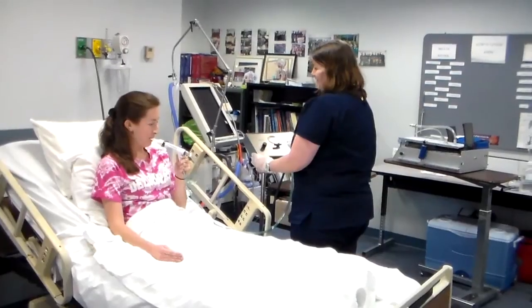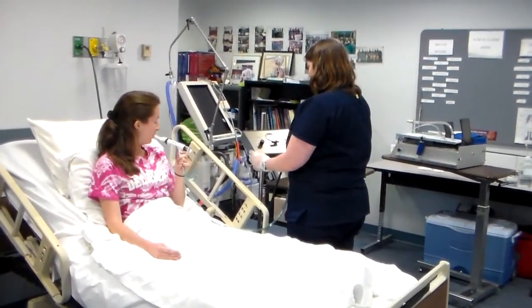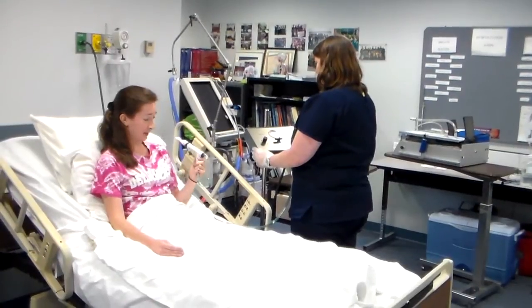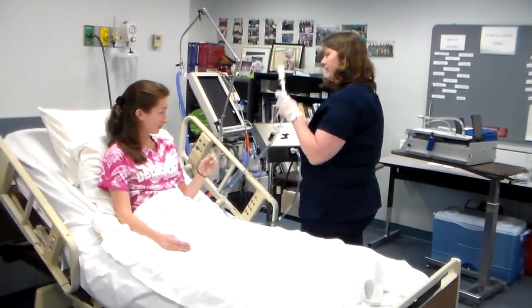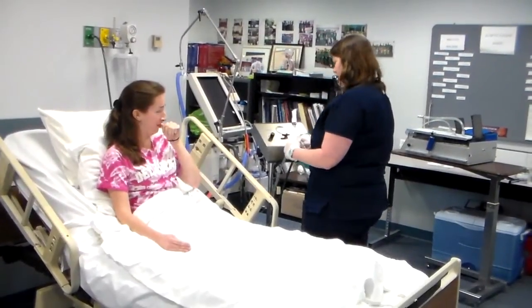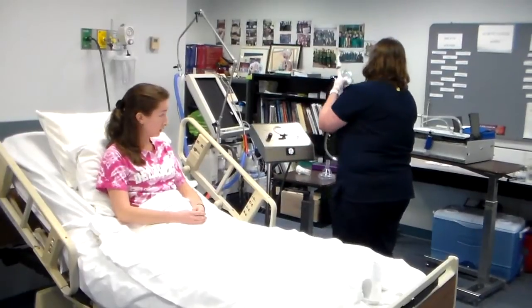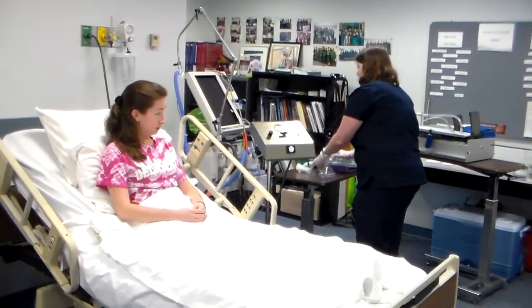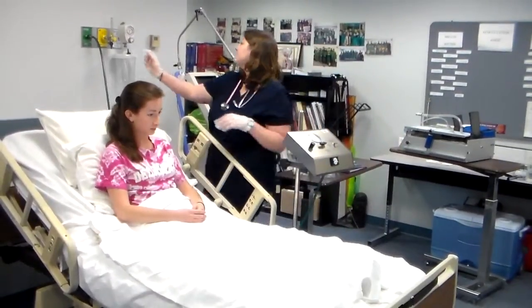Metaneb treatments generally last 5 to 10 minutes. When finished, turn off the unit. Unplug the O2 source. Ask the patient to cough. Provide tissues or a sputum cup for any secretions. And reassess the patient and document the procedure.